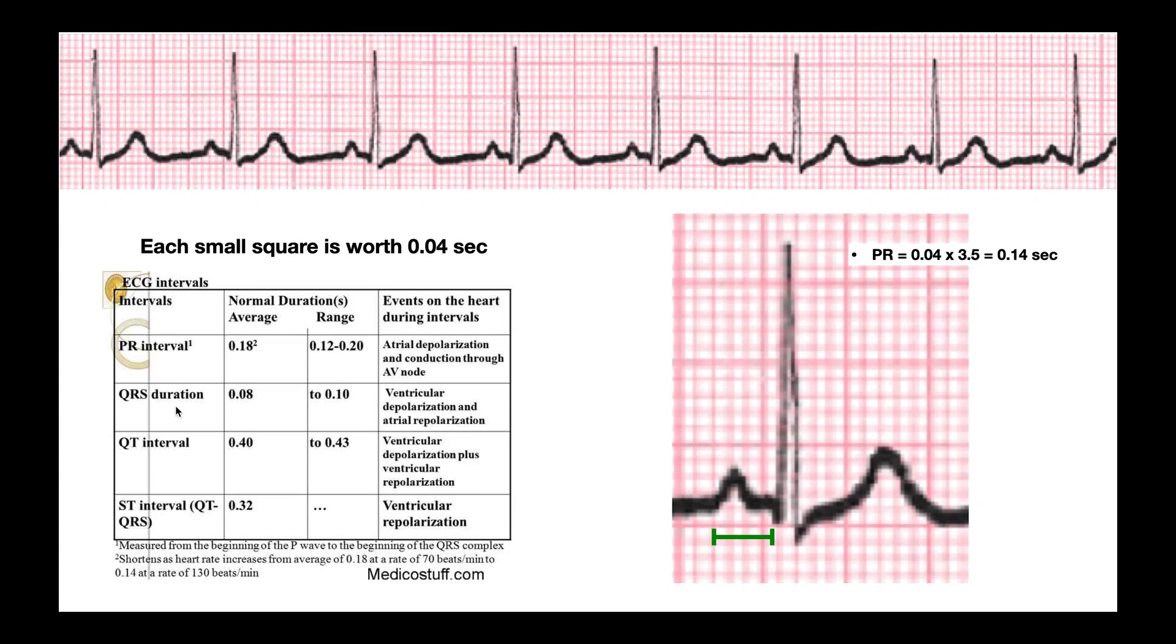Next we'll do the QRS complex itself. The QRS complex has a range where it basically has to be less than or equal to 0.10. Sometimes you'll see 0.06 to 0.10, but as long as it's within that range, it's fine. We don't want it more than 0.10 seconds. So let's do the same thing. Remember that the QRS complex, we measure from the initial deflection downward, so right where it starts to deflect downward here, and then we end it where it ends that deflection upward. So right here it starts deflecting downward, and there's Q. And then here's R at the top, and then here's S down here, and then from S it starts to go back up. And we'll call it right here where it's all the way back up. And so we just measure that distance. Again, we're going to kind of have to be a little bit rough here because of the resolution, but here's one box right here, and then there's a half a box on either side of that. So we're going to call that two full boxes.